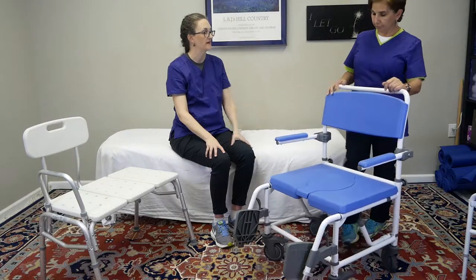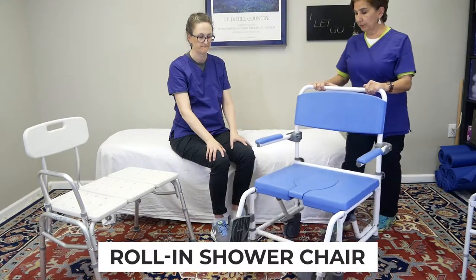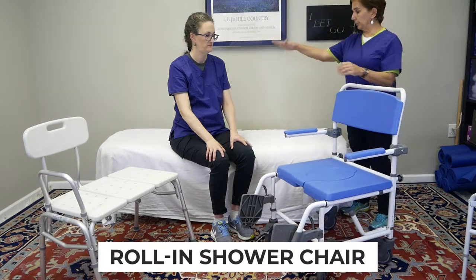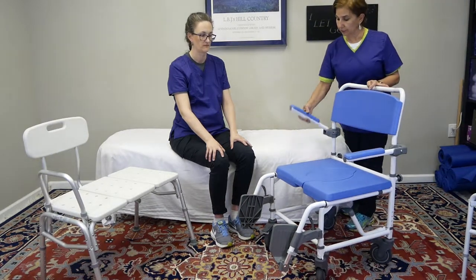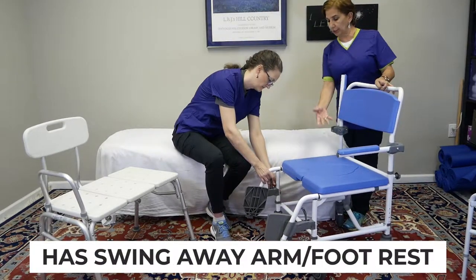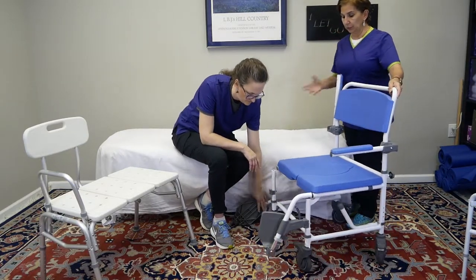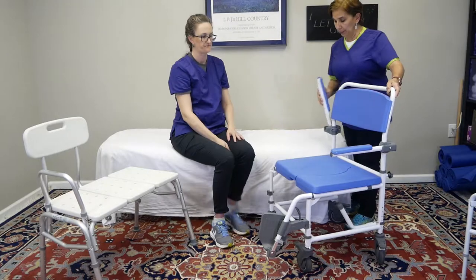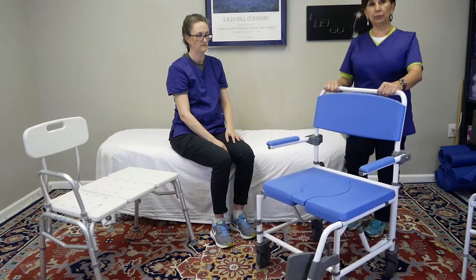This is a good example of that — a roll-in shower chair. What's nice about it is you can transfer someone right from the bed and roll them into this chair. It has a removable swing-back armrest, so you can transfer them in easily. It also has swing-away footrests that you can pop off, get someone seated, then put the footrests back on and roll them into the shower.